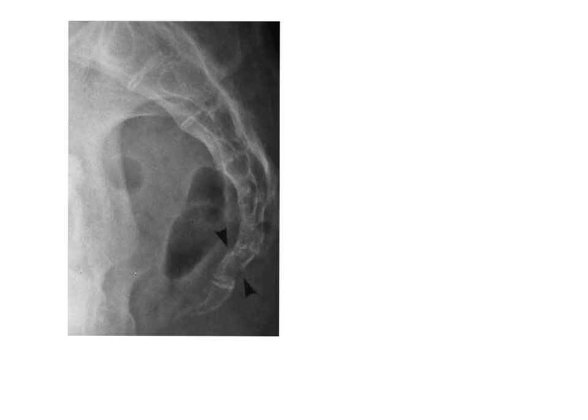All right, here is our lateral sacrum and coccyx. We automatically know that this is not a passable image because we do not have our lead marker. But we also do not have, and what should always be included is L5, S1 intervertebral disc space, which is missing, and a little bit of the L5 vertebral body. Think of it almost like an L5, S1 spot projection. So we must include that for it to be an acceptable image. We've also cut off the top part of our sacrum, which would demonstrate the sacral promontory. And this area here is the sacral base.